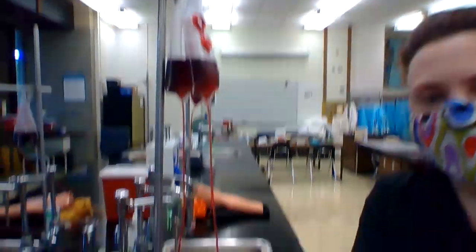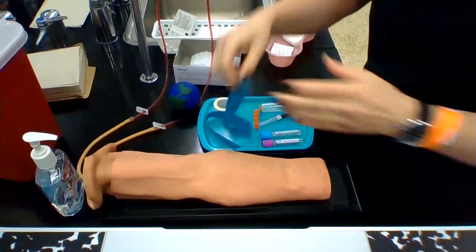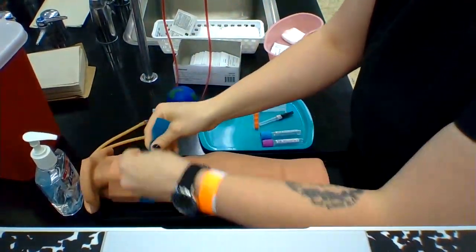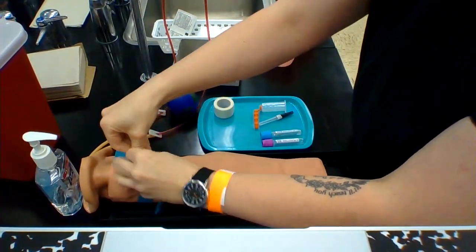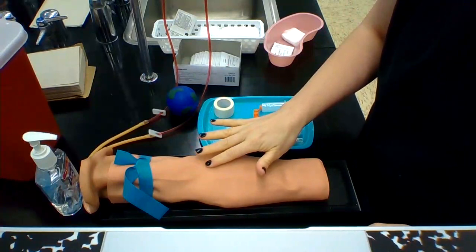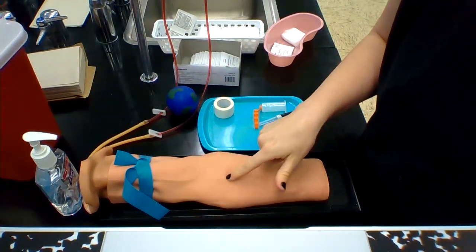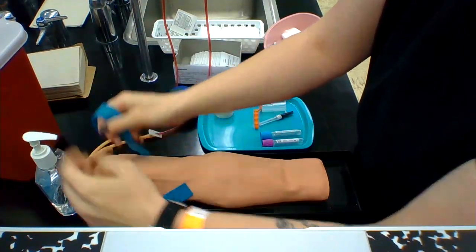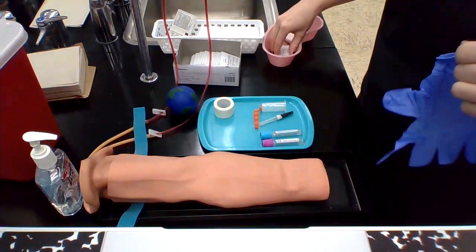Alright, so here's our arm. Start out by applying your tourniquet. Pat around, look for a vein, find a landmark, know the direction, undo the tourniquet, gather supplies.